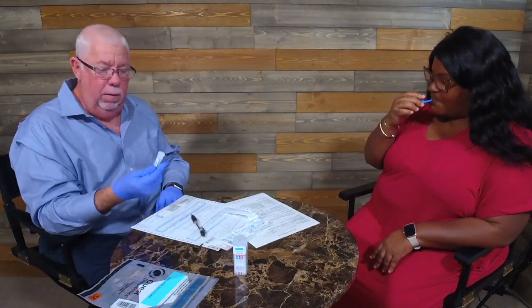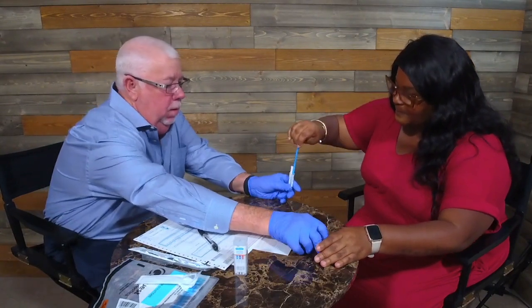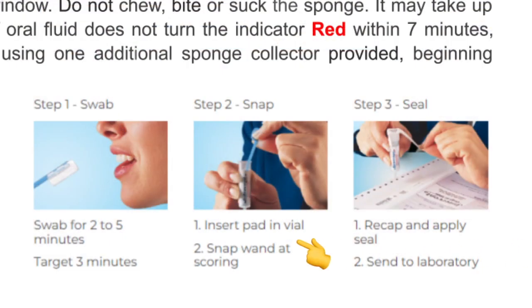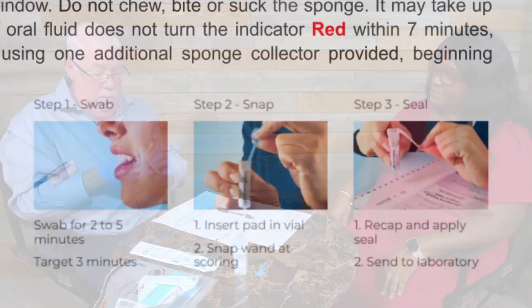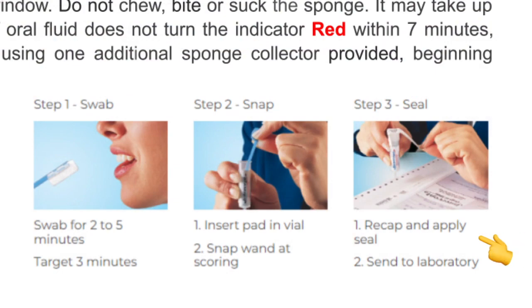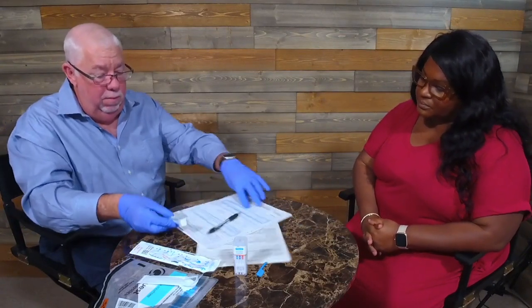And I'm going to go ahead and have the vial ready where this is going to go into. Five minutes later. Okay, so it looks like our 5 minutes has come and gone, so if you can go ahead and just stick that in that tube right there. Alrighty, and that breaks off right there. And I'm going to go ahead and seal this up. And then I'm going to put a tamper evidence seal on that. And that tamper evidence seal has the same ID number that's on the form, if you want to verify that.